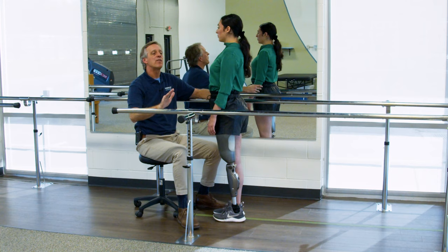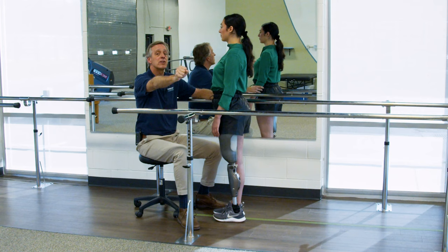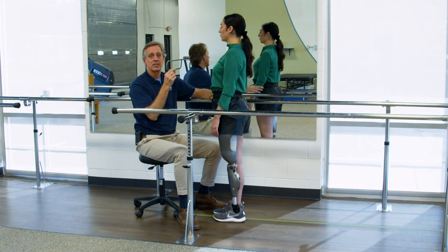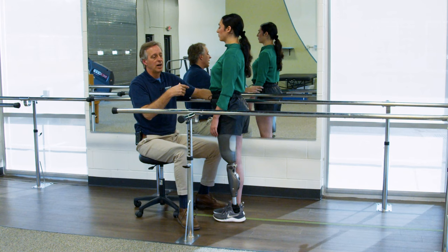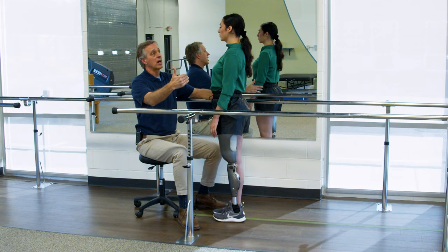Because when you're just getting started, that leap of faith to throw yourself out there on the prosthetics is a little bit harder. But you'll see from her how quickly, once she started to take the long stride, boom, she just took right off. Her speed picked up dramatically, but she didn't have to run. There was no going into a running mode at that point in time. It becomes very effective, very efficient. And then we'll work on, here in a second, controlling and changing those modes and speeds. You want a normal walk, a long stride, and a short chop step.